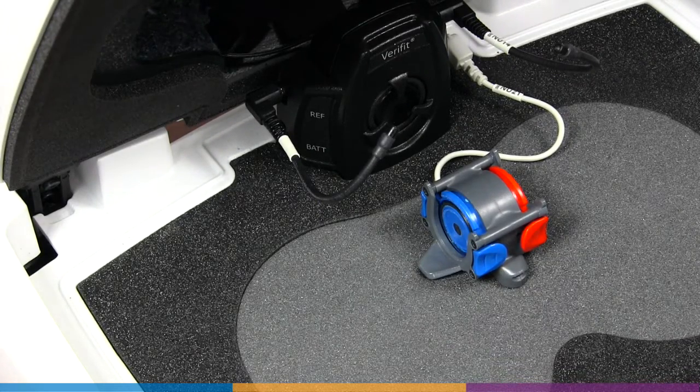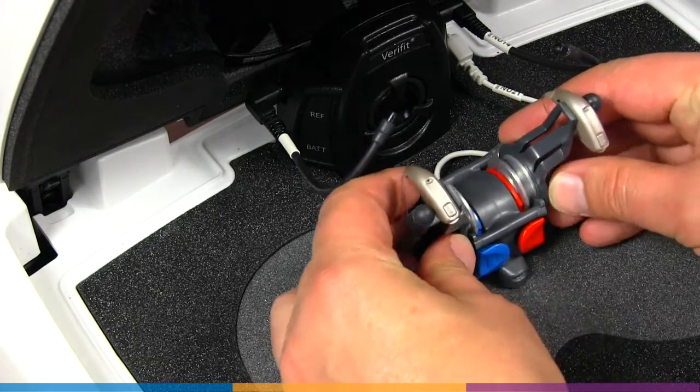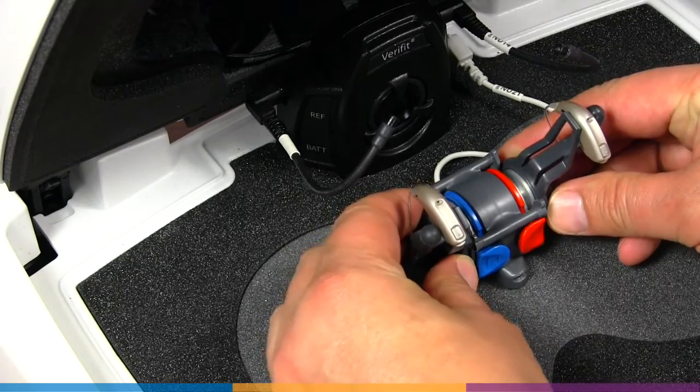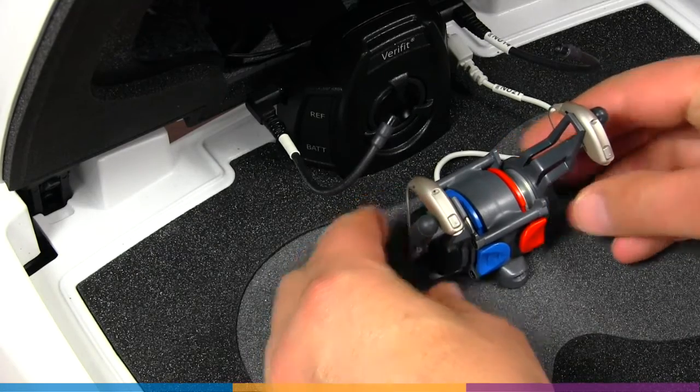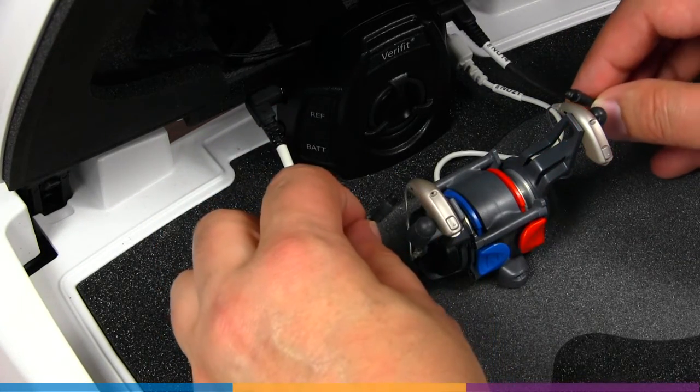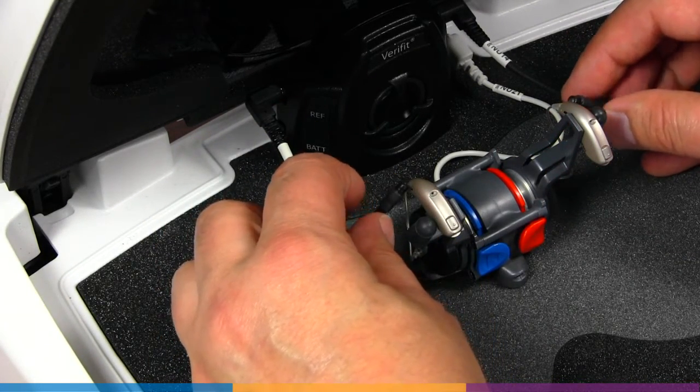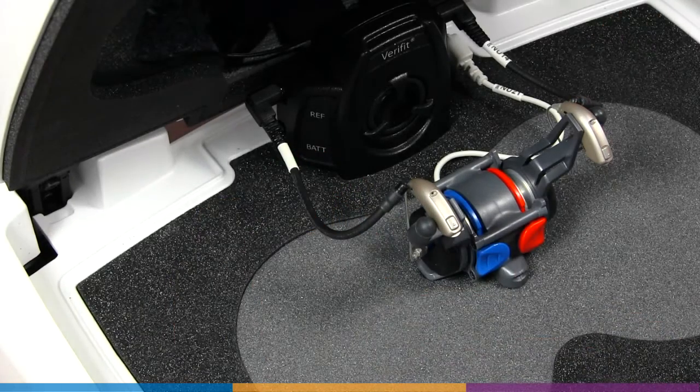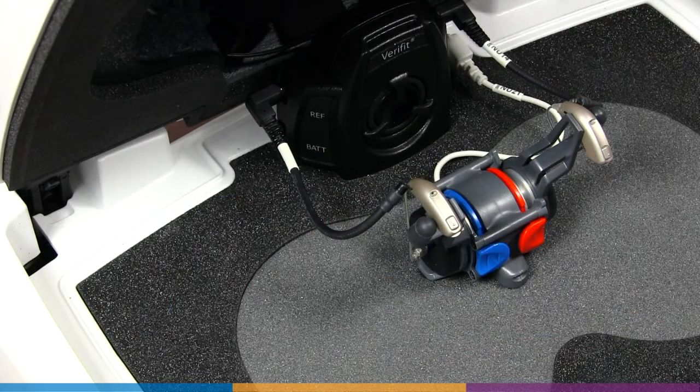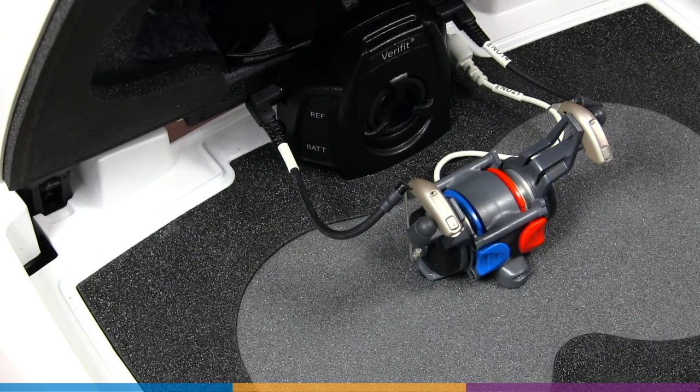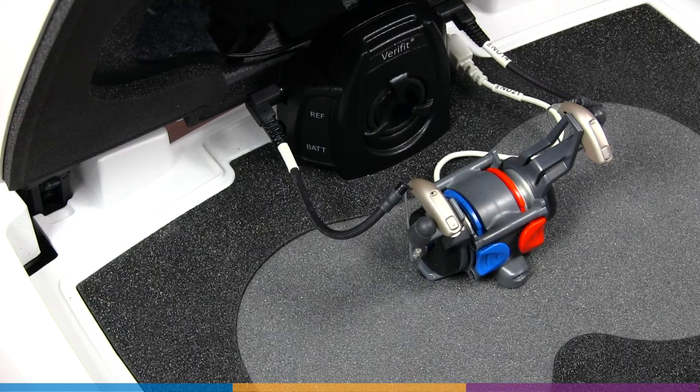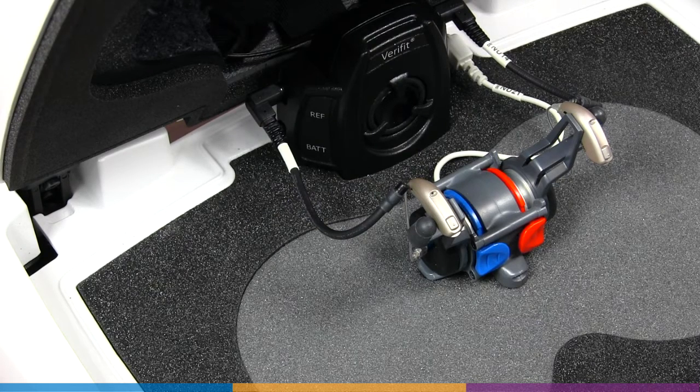As long as both reference microphones and hearing instrument microphones are equidistant from the speaker, the stimulus presented to each will be equivalent.